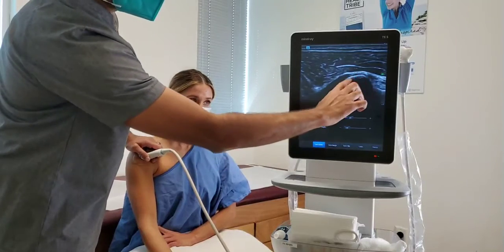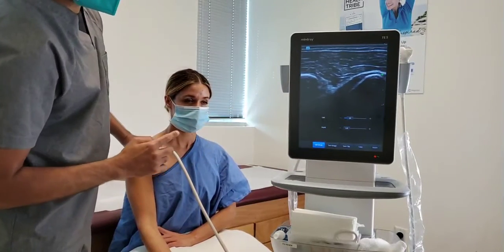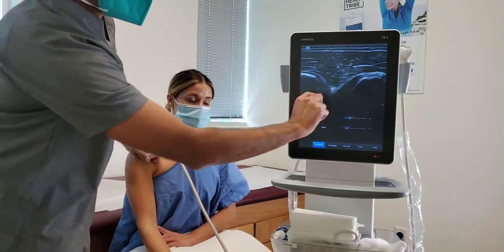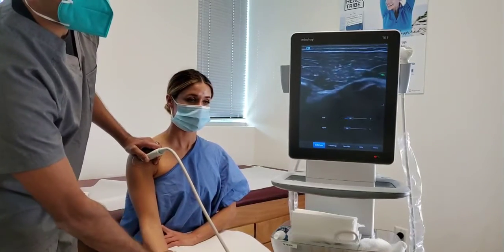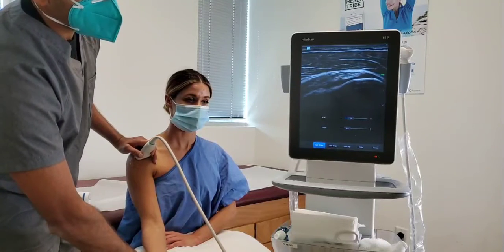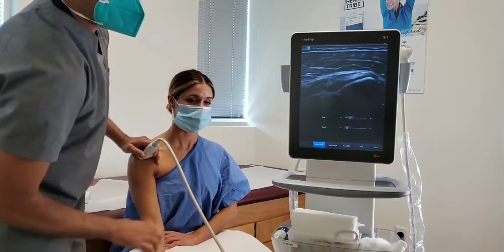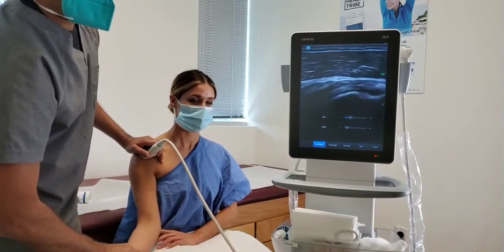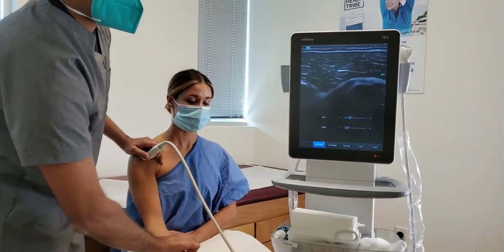So this again is the humerus, or the arm bone. This is what's called the coracoid process, which is a bone that sticks out from the shoulder blade from the back. And this narrow structure here is the subscapularis tendon, which you can see a little bit clearer when I go like this. The tendon fibers are going in this direction and attaching onto the bone. And you can see how those tendon fibers actually travel underneath the coracoid process on the left side of the screen as I'm rotating the arm bone.